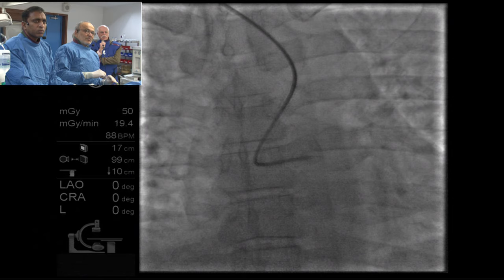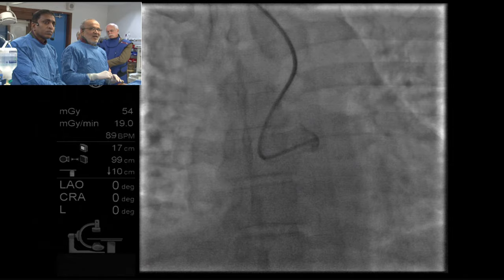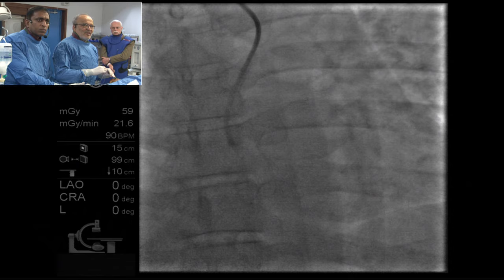The angiography was done by extra backup 5F that time? Yes, yes. I am concentrating, my eyes are on the tip of the guide rather than thinking of clockwise or counterclockwise rotation. In this case, it's going to give us a little bit of a hard time, I think, but let's see.